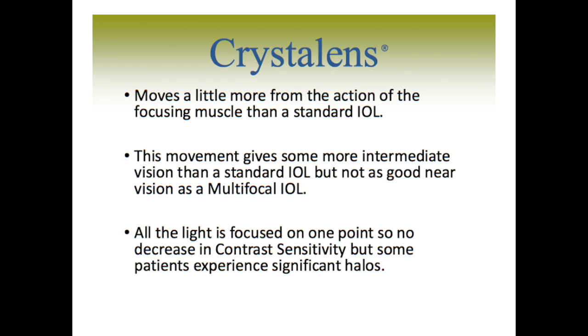Therefore, this movement gives some more intermediate vision than a standard intraocular lens, but not as good near vision as a multifocal intraocular lens. All the light is focused on one point because it's a monofocal lens, so there's no decrease in contrast sensitivity, but some patients experience severe halos.